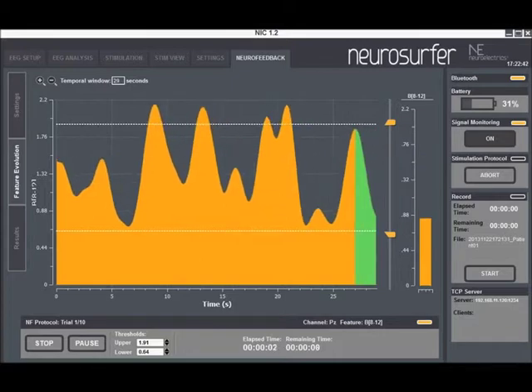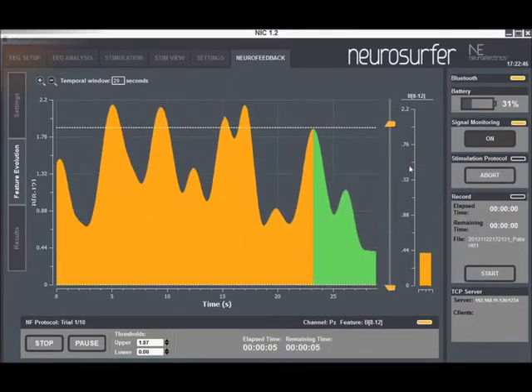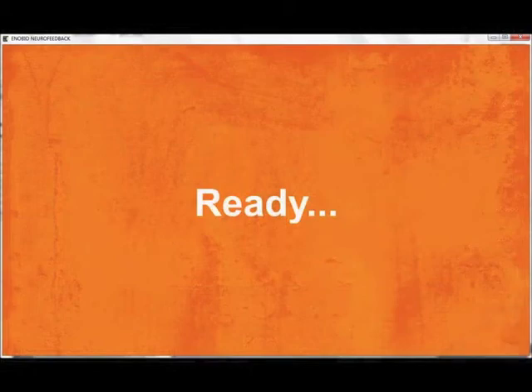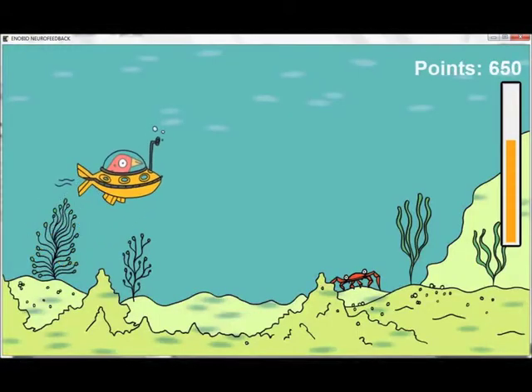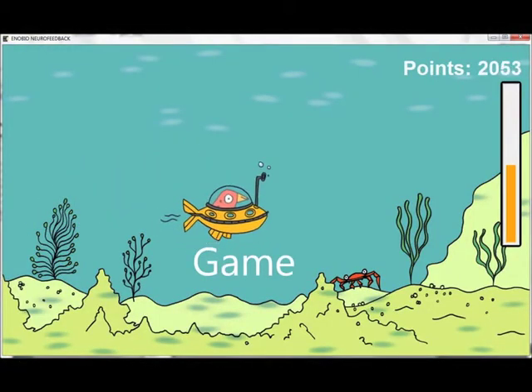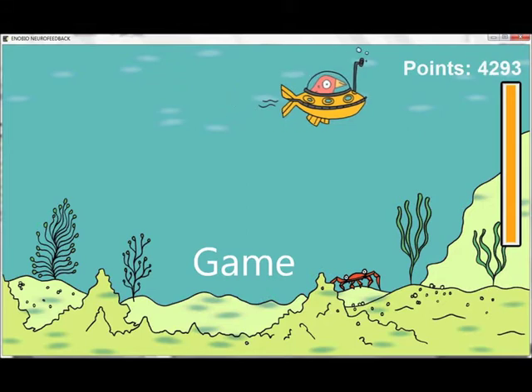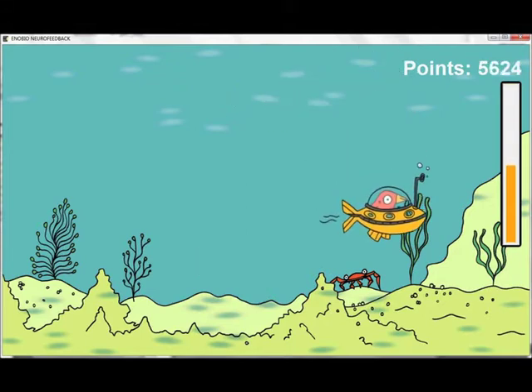The patient is shown a separate screen where the game takes place. In this screen a character responds to the chosen EEG power feature, and performance is rewarded using a simple point system.